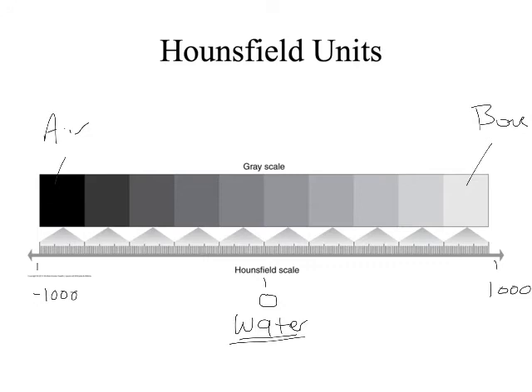So all of the shades of gray run those differences between, for example, air and water, or bone and water, right? So there's not a lot going on the negative side of the Hounsfield unit scale. There is one thing that's interesting that's less dense than water, or has a lower linear attenuation than water, for an interesting reason, and that's lipids, fat.